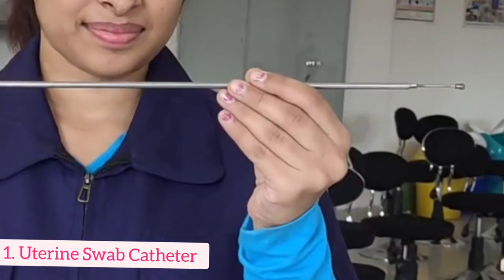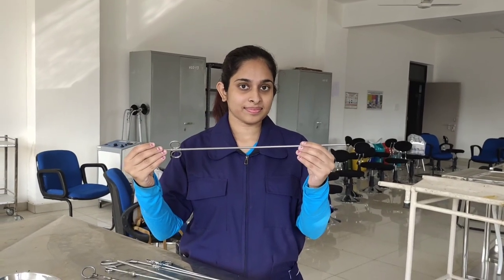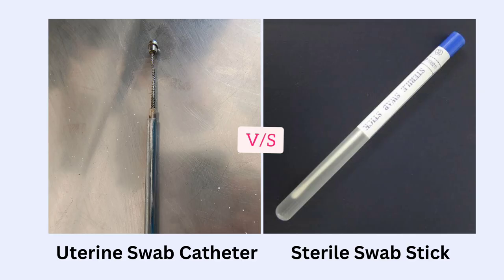First we have this uterine swab catheter and as you can see in the close up, it pushes out like so. We can roll a cotton swab on this end and take the sample. Since we are manually slicking back the covering to expose the swab, the advantage of this uterine swab catheter over the conventional sterile swab sticks is that we can take a sample of a specific point, whereas a swab stick could have been contaminated from the neighbouring tissues.